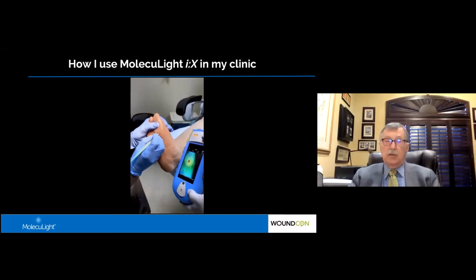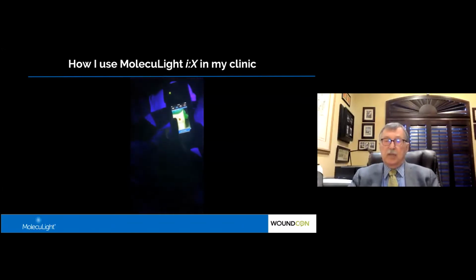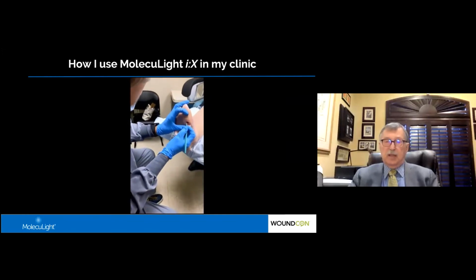What I'm doing at this point in time is debriding that wound with a curette, and the nurse is actually holding the image so that I can use that image to help guide debridement. So we may, depending on what the image demonstrates, focus on a specific area.